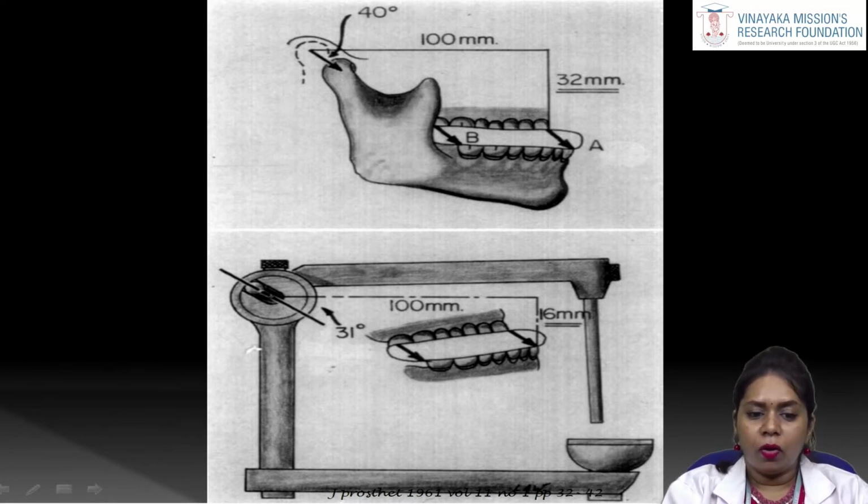This lowering or raising of the facebow mounting does not actually affect the centric occlusion. However, it does have an effect on the eccentric condylar readings which influence the cuspal inclination. For example, as the plane of occlusion is elevated, the condylar readings decrease. Conversely, as the occlusal plane is lowered, the condylar readings will increase.